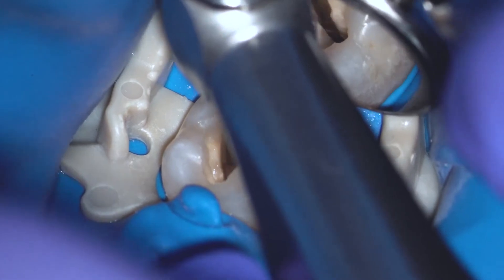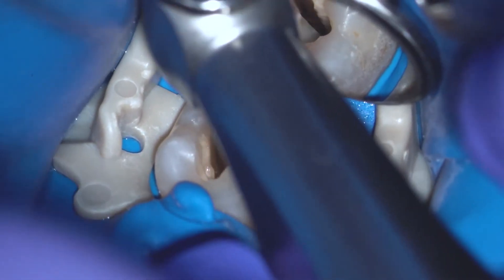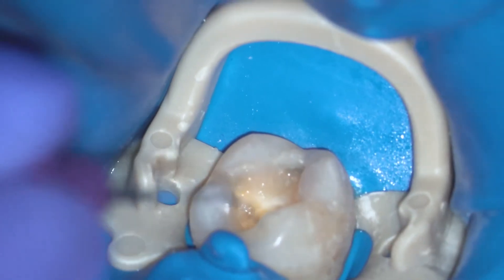Now you can use the orifice opener file which will in a very beautiful way shape the coronal part of your root canal. At this level, in most canals, you will be ready to establish the working length and establish the glide path — for example with K file number 10, or if available, number 15.